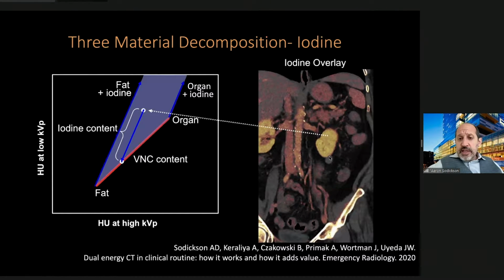And here you can nicely see that there's no orange in that lesion. There's no iodine. We can very quickly see that this is a non-enhancing lesion and dismiss it as benign.